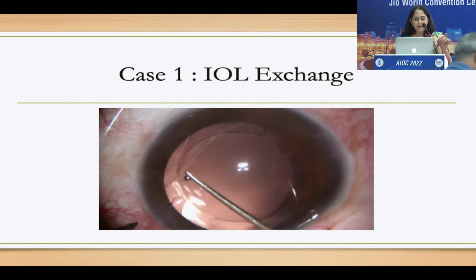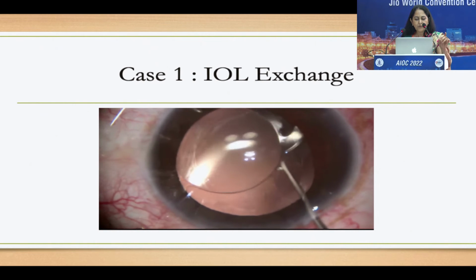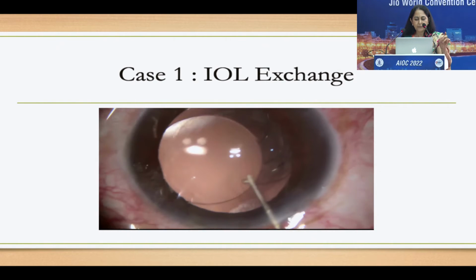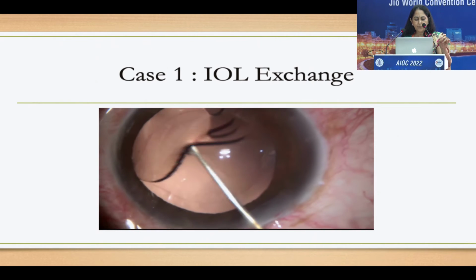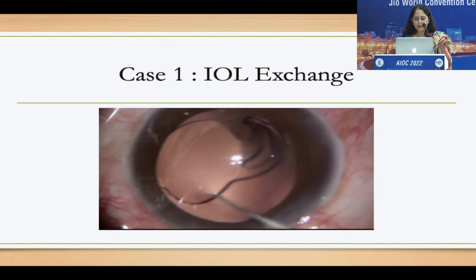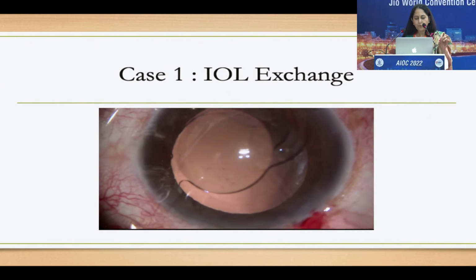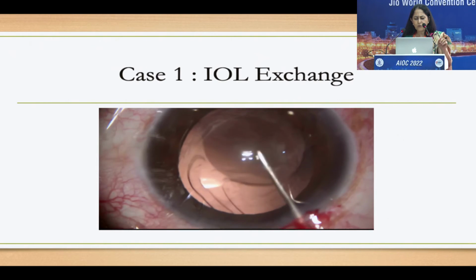If you see that the lens is moving without causing much force onto the zonules, again put in more viscoelastic and lift the lens to prolapse it into the anterior chamber very gently. First the first haptic, and then you need to put in more viscoelastic, lift it again gently and place the lens inside the anterior chamber, once over the anterior capsule. Once you've done that, you have to always be careful. It has to be very gentle maneuvering, because you don't want any force on the zonules.